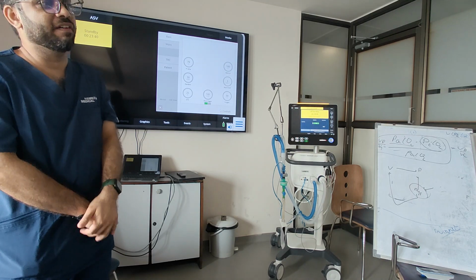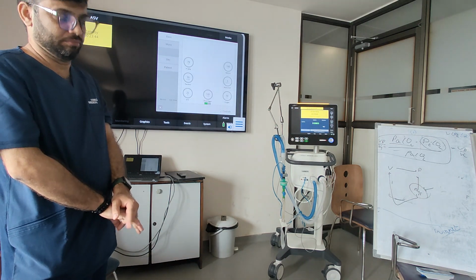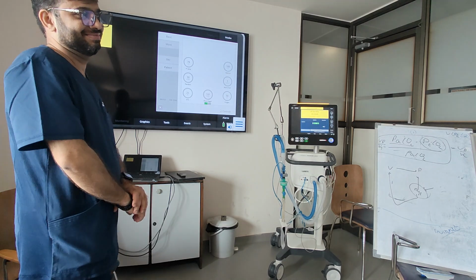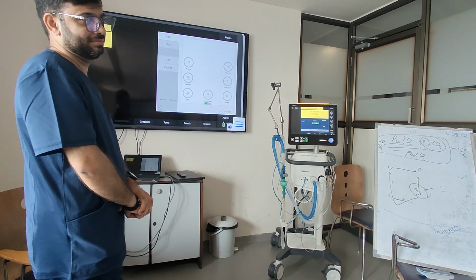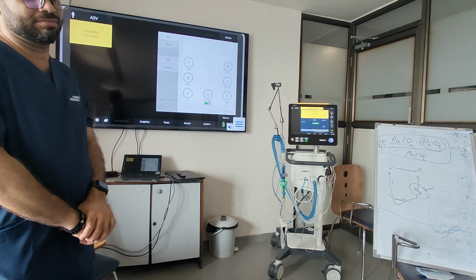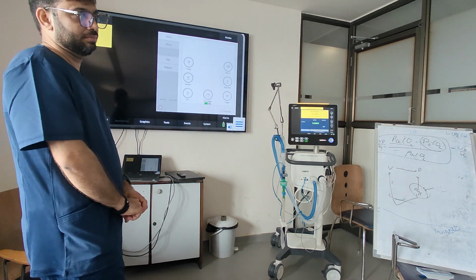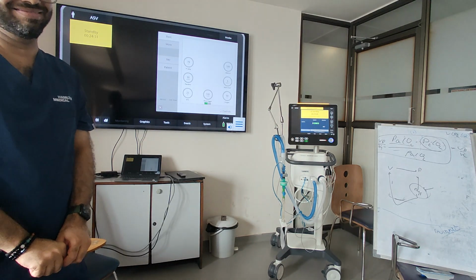Not C6, C5 is it? G5. It was all placed on top. And I saw a patient coming inside. The first mode they used was always control mode. So I happened to ask Arnal, why are you using control? Just now we were talking about ASV, why are you using control? He said, no, let's not use it for the sick patients. And then he explained to me that in a sick individual, the ASV is not performing very well. We need the sickness to reduce a little bit. So a person with so much experience, Arnal, also starts with CMV and then goes to ASV mode.